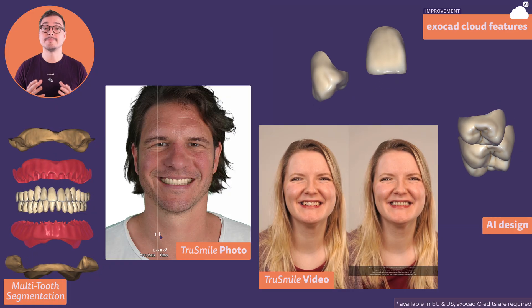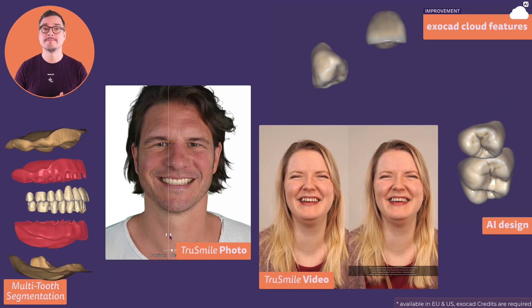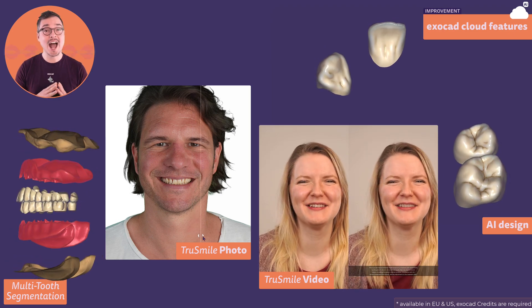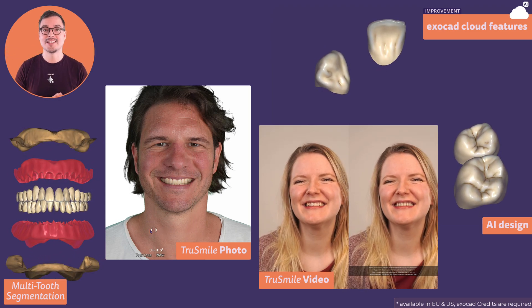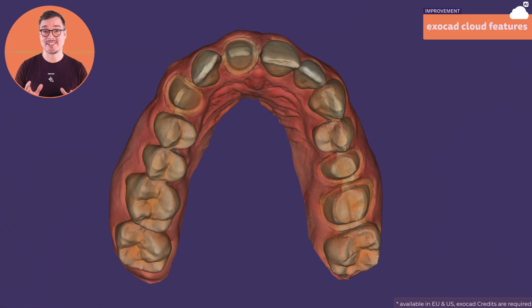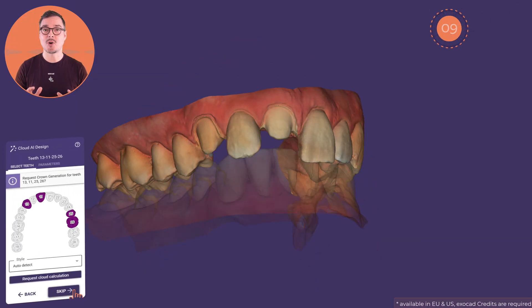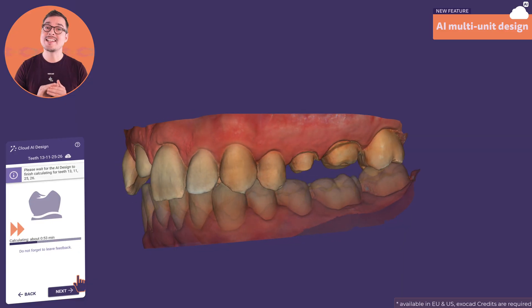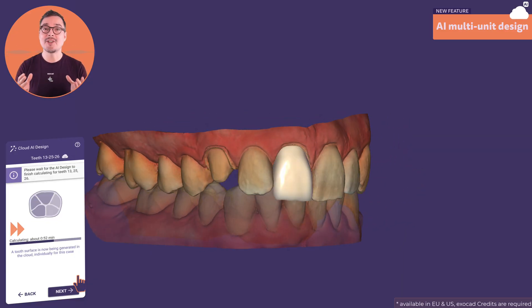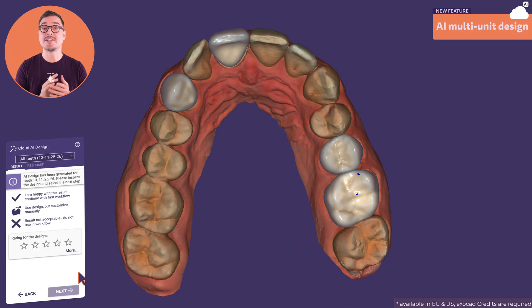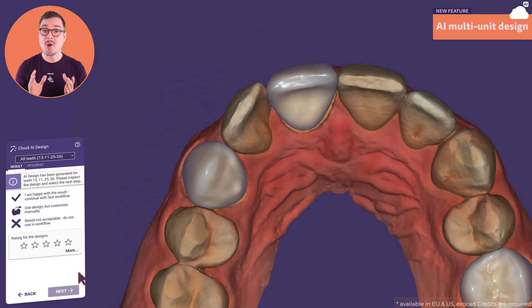TrueSmile Photo and TrueSmile Video provide your patients highly emotional visualizations of their treatment outcomes, and AI Design speeds up the workflow by delivering high-quality design suggestions. Let's start a case with multiple single crowns and request a calculation. By default, the auto-detected design follows the given morphology of neighboring and opposing teeth. For single crowns, the cloud calculation usually takes about two minutes — and the results are impressive.